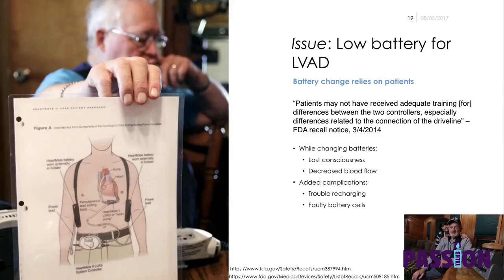But on the other side, there have also been many patients. In the process of using this device, it must require a battery replacement, and these patients are untethered. In the process of changing their batteries, they actually lost consciousness, and some died. To complicate things further, there were other manufacturing issues with the batteries that made it even more challenging for the users, right?